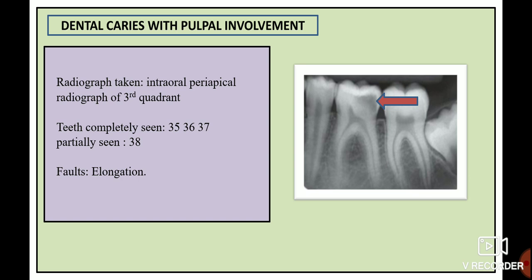The tooth of interest here is 36. In the crown portion, there is an ill-defined radiolucency in the disto-occlusal aspect which is involving the pulp. In the alveolar crest region, the alveolar crest is at 1.5 mm below the level of the CEJ, which is a normal feature.